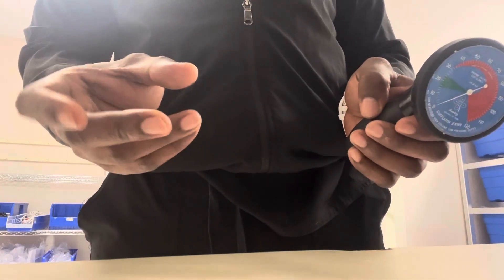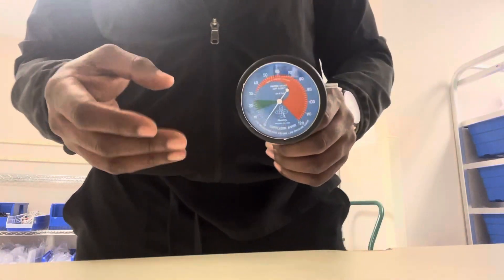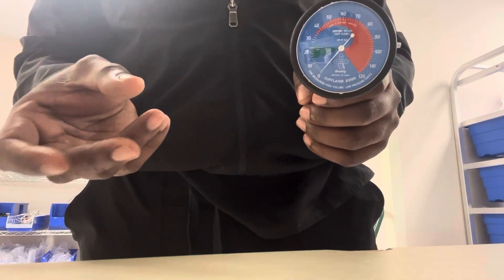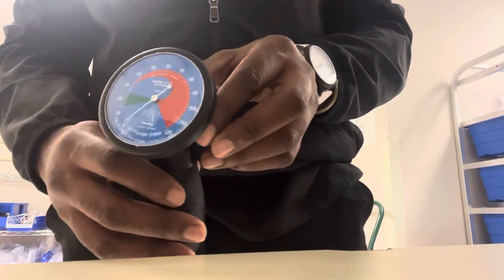A lot of times you can feel the cuff to see how much inflated it is. You can't really get an accurate reading, but you don't want it too full or not full enough. This is a useful device that we have — the pressure cuff manometer.